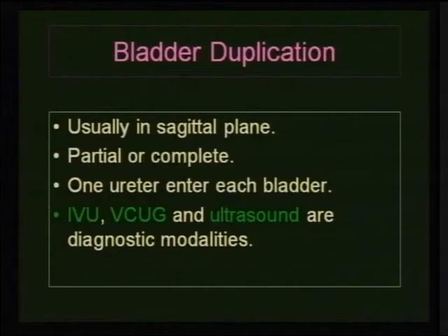Urinary bladder, we have to watch the shape of that urinary bladder. A normal urinary bladder will look like a balloon and it will contract slowly like a balloon until it empties completely. This is normal detrusor muscle contraction.